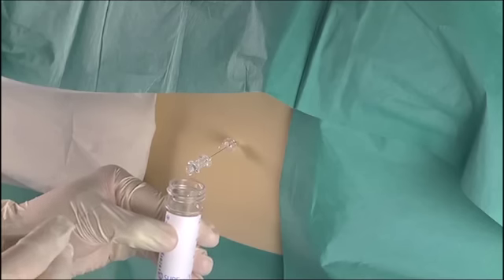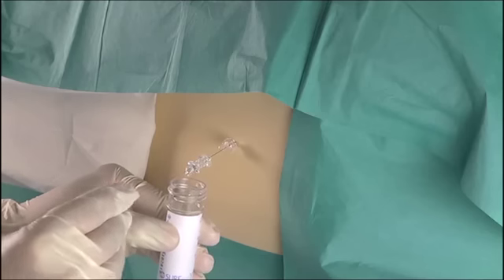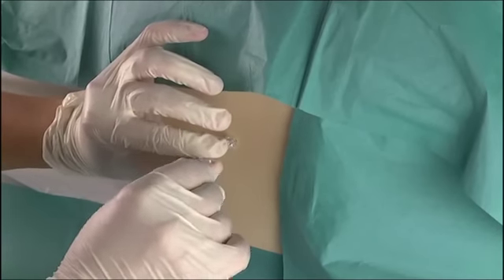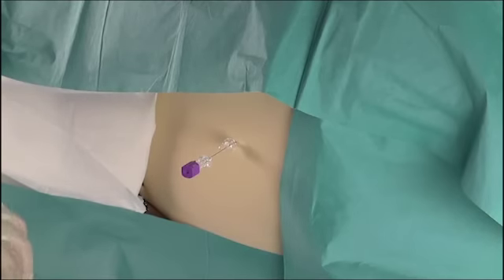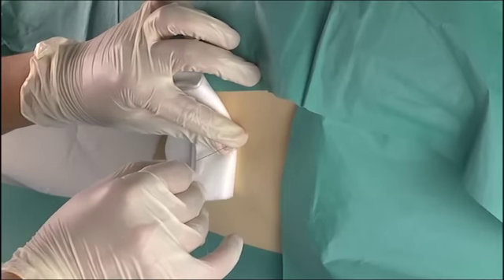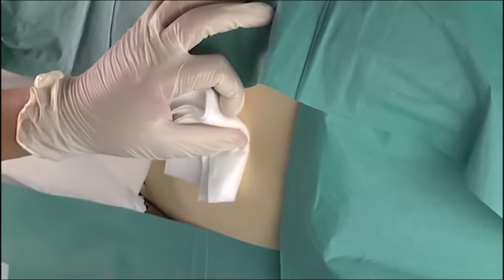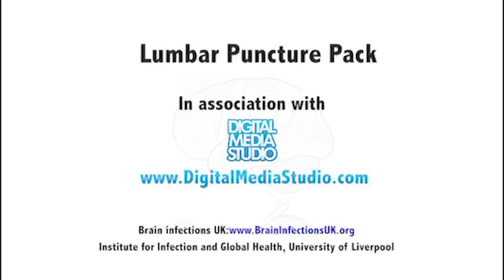When you have completed this, reinsert the bevel stylet needle. Make sure this is clicked into place. Take a piece of sterile gauze, remove the lumbar puncture needle, and then the insertion device. The pressure from the sterile gauze reduces the bleeding and post-procedure bruising, and that is how you perform a lumbar puncture.